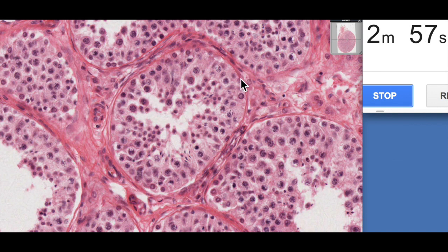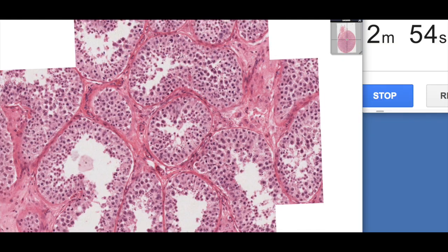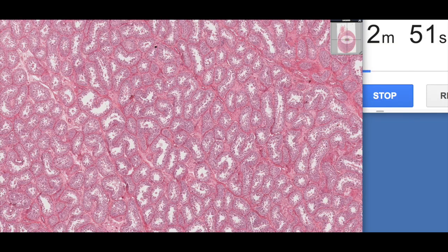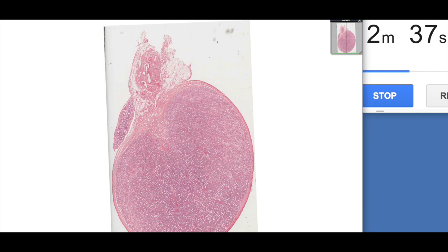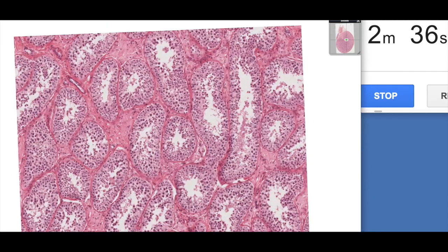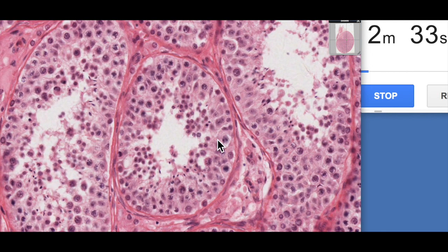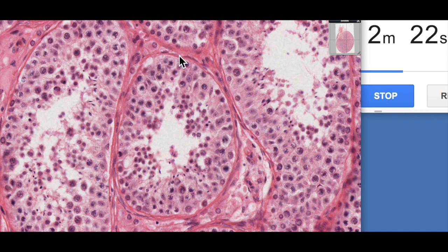We have a magnified H&E-stained section of the testis here. Zooming in, you can see the dense connective tissue capsule — the tunica albuginea — and all of these seminiferous tubules. On the outside of the seminiferous tubule, we have myoid cells. These flatter nuclei belong to several layers of myoid cells, which are contractile.